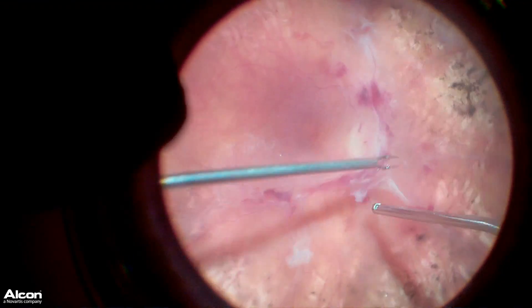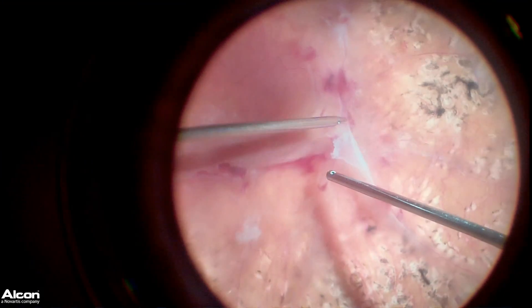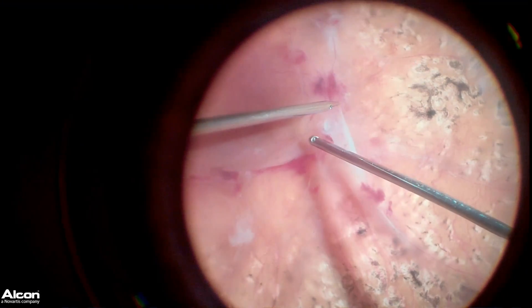Typically when we're performing a tractional retinal detachment repair, most surgeons will utilize a light pipe in one hand and the cutter or the forceps in the other hand.